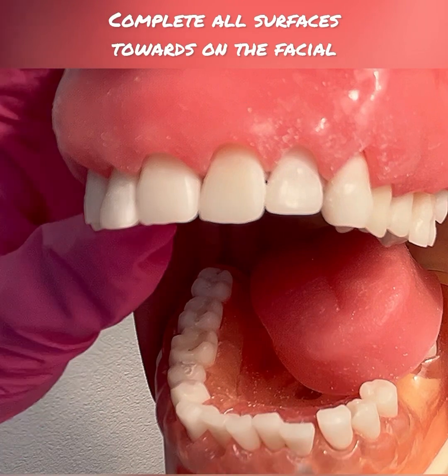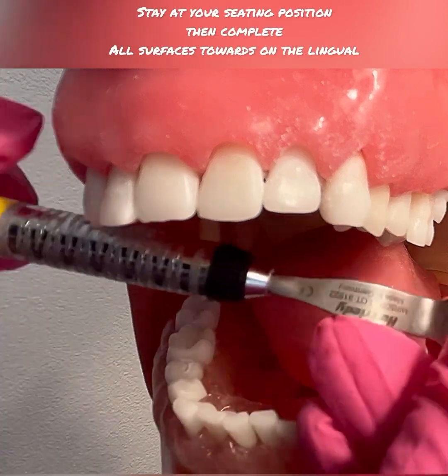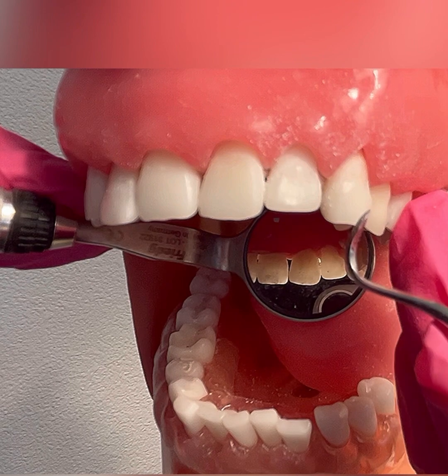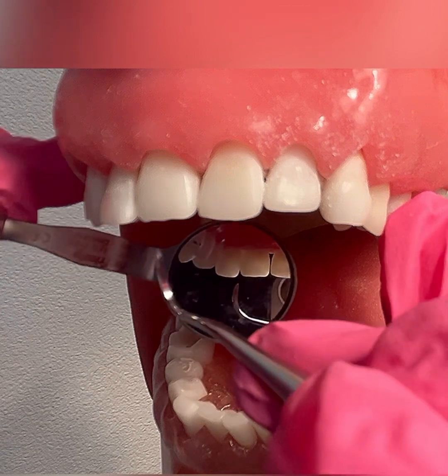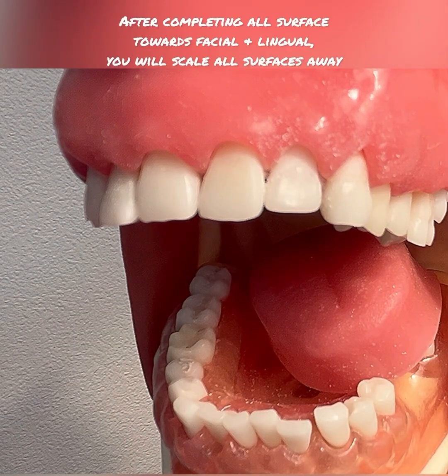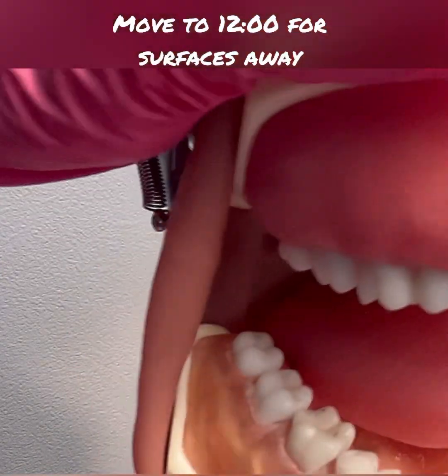You would continue completing all surfaces towards on the facial. Then you would stay at your seating position, get your mirror, and complete all surfaces towards lingual — for right-handed clinicians starting at tooth number 11 going to tooth number 6, and for left-handed clinicians doing lingual surfaces towards from 6 to 11. After you complete all surfaces towards facial and lingual, you will then move to the 12 o'clock seating position for both right-handed and left-handed clinicians, and then you would scale surfaces away.